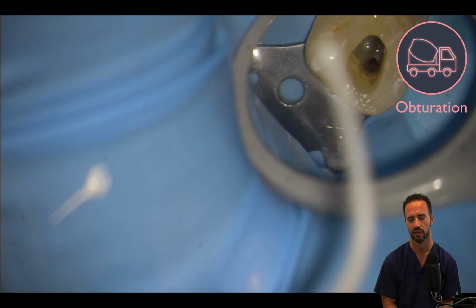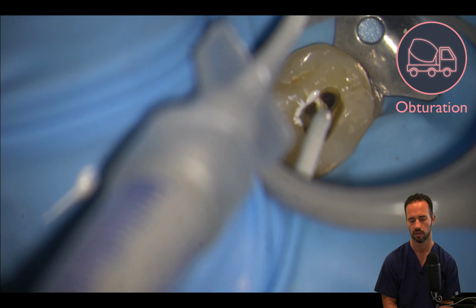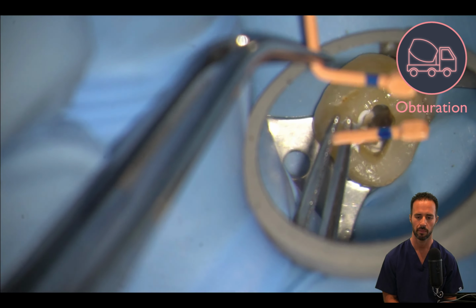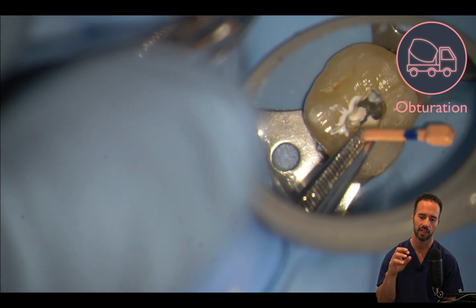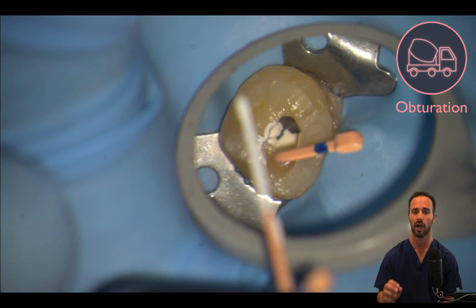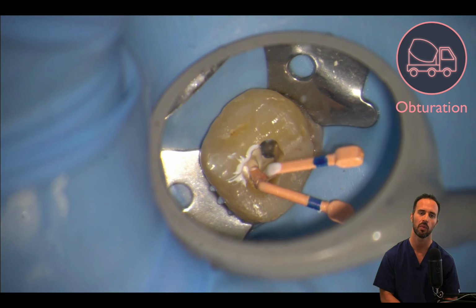And now we're going to go ahead and introduce our sealer. Good. Remember, always with a passive seat of the tip. And now we're going to seat our gutta percha cones. Remember, we're typically going to be using gutta percha cones that are one size lower. So in the buccal canals, remember we finished with a size 35 rotary file, so we're using a size 30 gutta percha cone. However, in this case, knowing that the palatal canal is so large, we're going to actually use the same size gutta percha cone that we instrumented with.